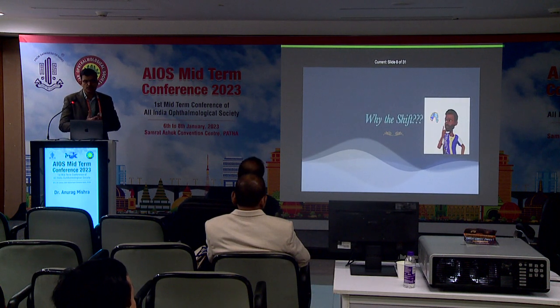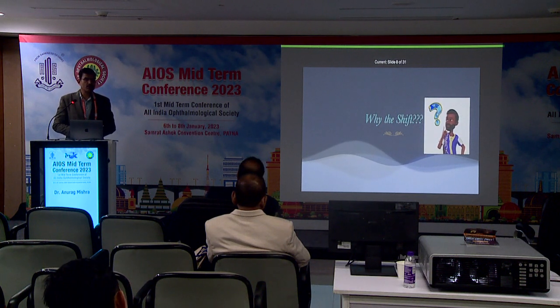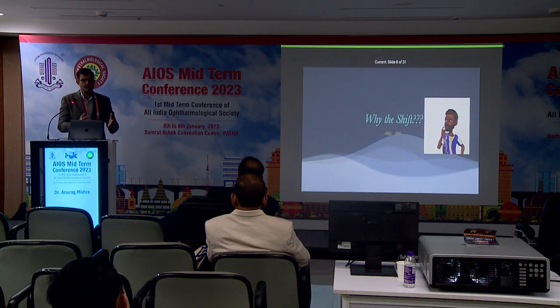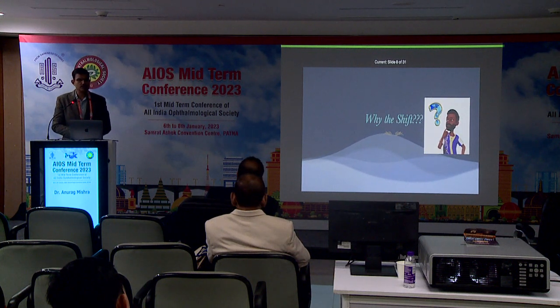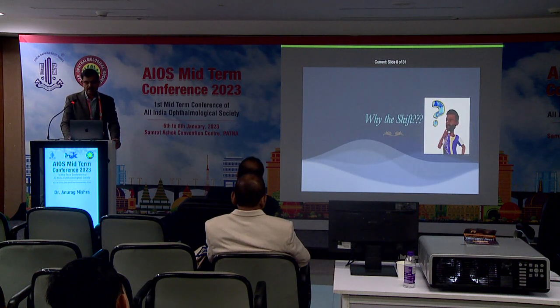Recently I had an issue with the irrigation sensor in the handpiece not being able to calibrate itself properly. So if you're using Active Sentry, just be watchful, because at times the machine might not be able to calibrate itself. You might just have to shift to the non-Active Sentry mode, as there's some issue with the handpiece. The engineers are still looking into why it happened.